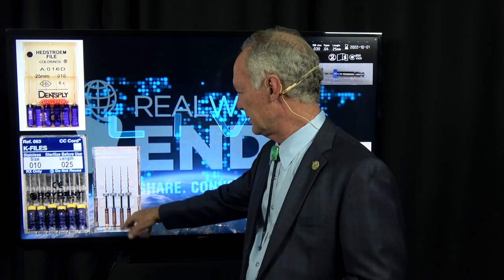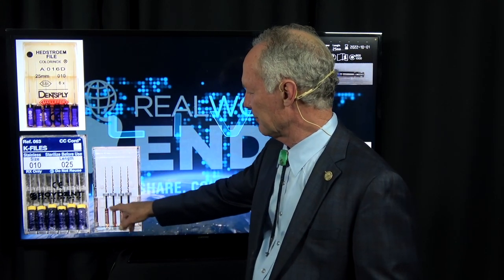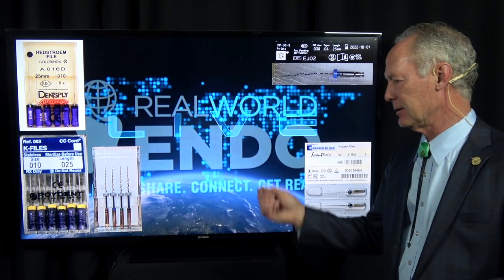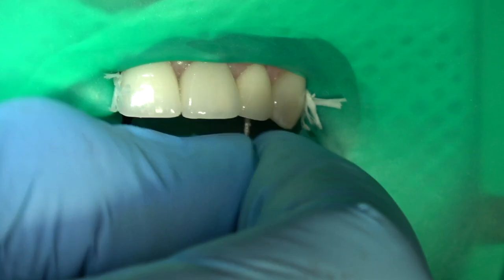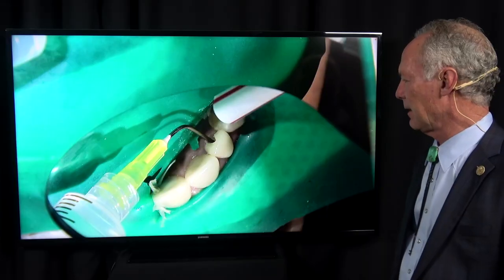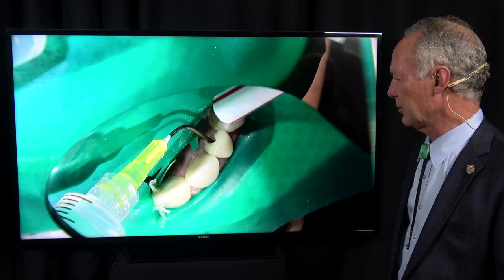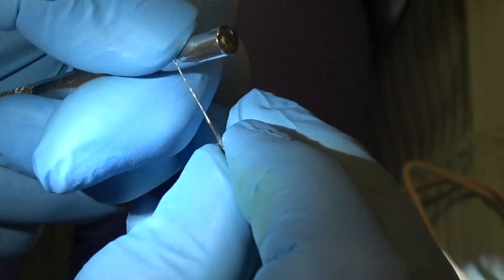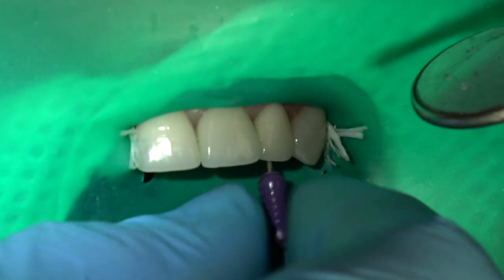I usually use these four files — small, medium, and large — and then hedström files for the initial cleaning. This is a hedström file; I'm just cleaning it out really well and then irrigating with three parts water, one part sodium hypochlorite. I'm not putting pressure, just placing it into the pulp chamber.